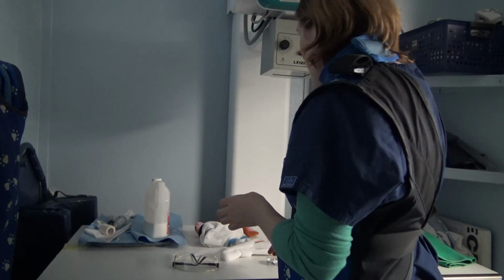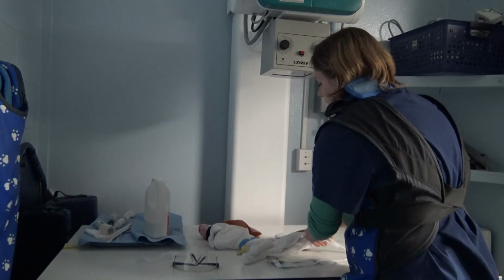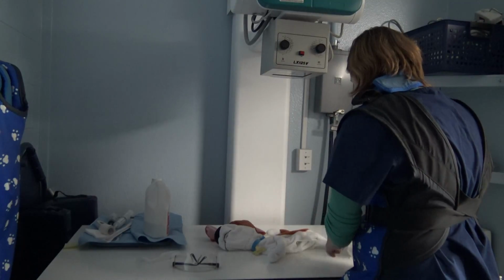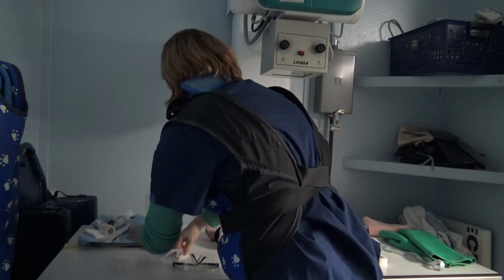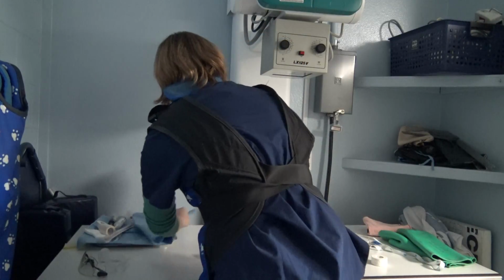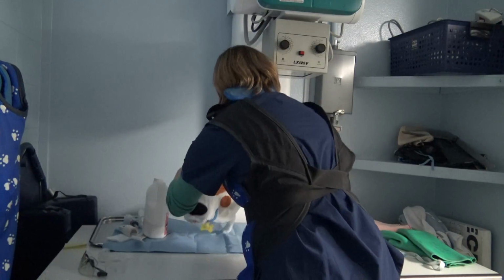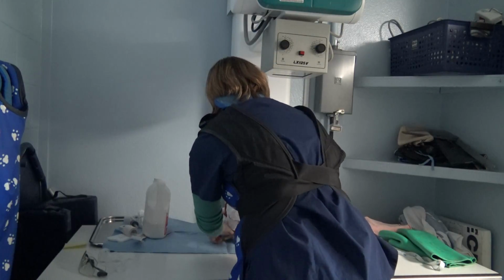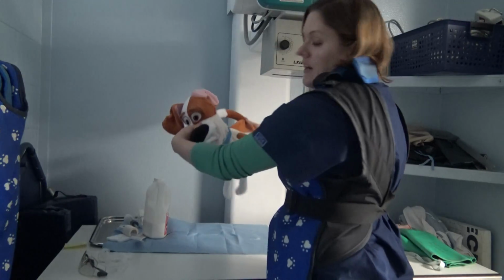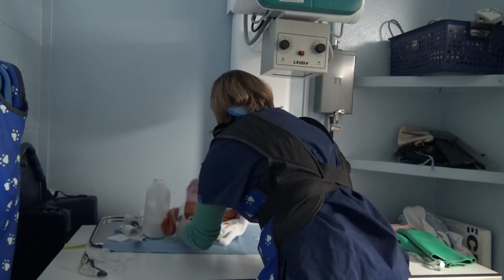So now that we got our primary x-ray here, we're going to go ahead and demonstrate how to give barium to our patient. And you see our patient is 18 inches here, a dog today.